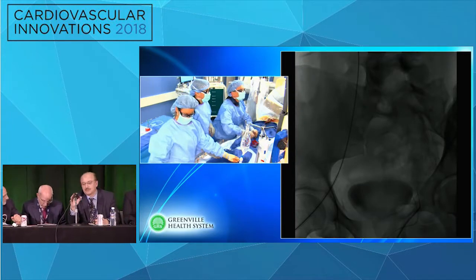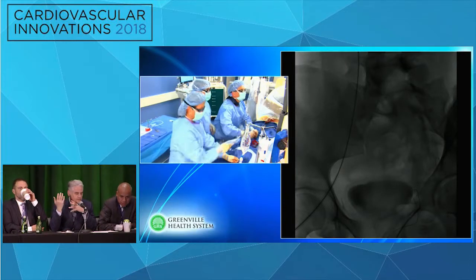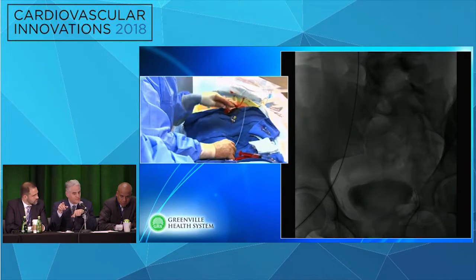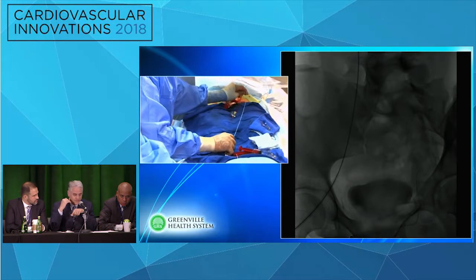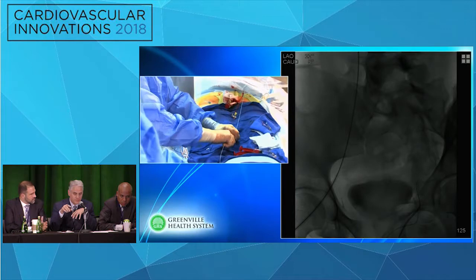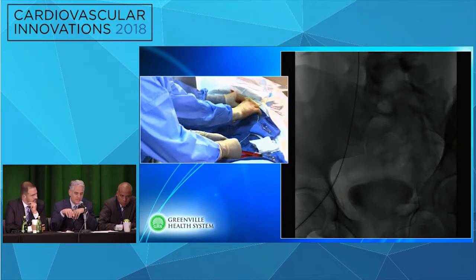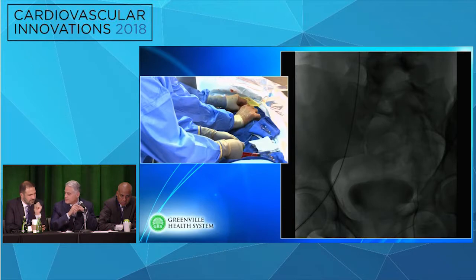Yeah. And the other thing is, eventually, once you get the wire across, you're going to probably put some Wallstents because that's all we have currently in the United States. And as you know, those sheaths are not very long. So if you're coming from the neck, you might have issues in terms of whether you are going to have enough length to actually stent and cover all of the diseased segments, because it looks like you're going to have to extend this down into and including the common femoral. So a retrograde left popliteal approach from the very beginning, I think, probably would have simplified this.